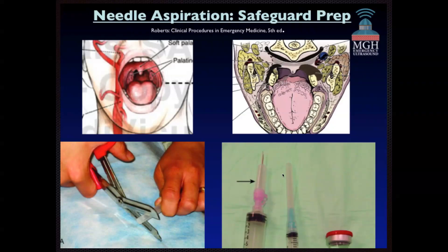No matter what approach you choose to use, it's always great to think about your safeguard preps. Here you can see how close the carotid can be to the area where you want to poke. Here we're doing a needle aspiration and we measured that the peritonsillar abscess fluid is about one to two centimeters from the surface of the abscess. So we cut the cap and put it back on the needle so that if the patient seizes or syncopizes — which has happened to me when draining an abscess, and I was thankful I had this cap on — it's actually a safeguard for you.